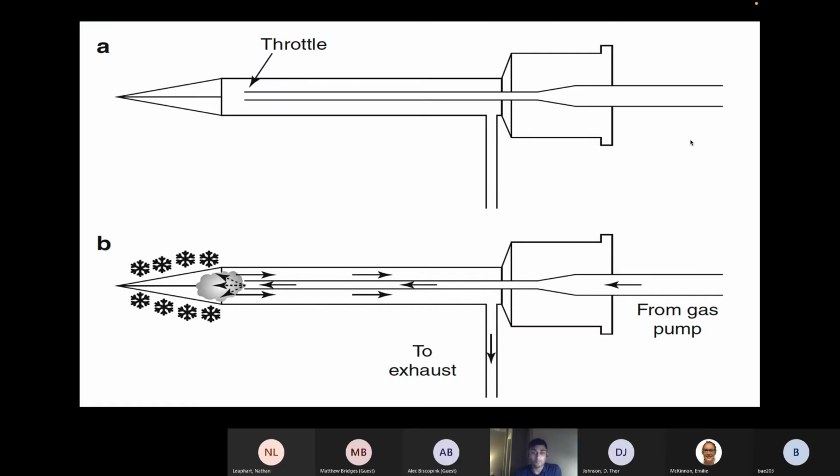And basically what it is, you have a liquid compressed gas that goes down a needle, and then there's a choke, which allows the gas to rapidly expand. And for those of you that have any recollection whatsoever of the ideal gas law, PV equals nRT, when you massively expand the size of the gas, the gas has to absorb energy, which then cools the tissue around the probe. And so we can actually cool these probes to minus 157 degrees centigrade. So that's pretty cold, with a standard cryoablation probe.